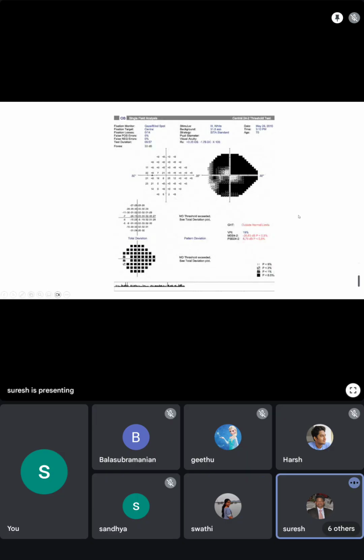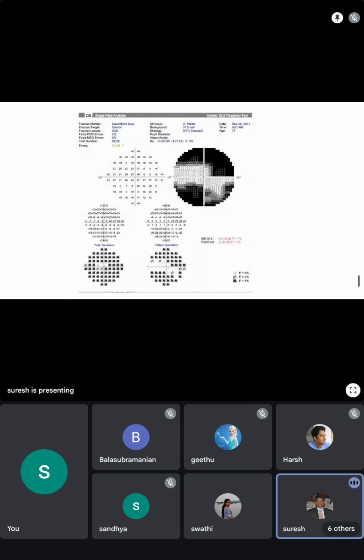Anyone? We go ahead and do a 10-2. Okay, to see if there is at least some amount of central vision present, before writing him off saying that nothing can be done for you.